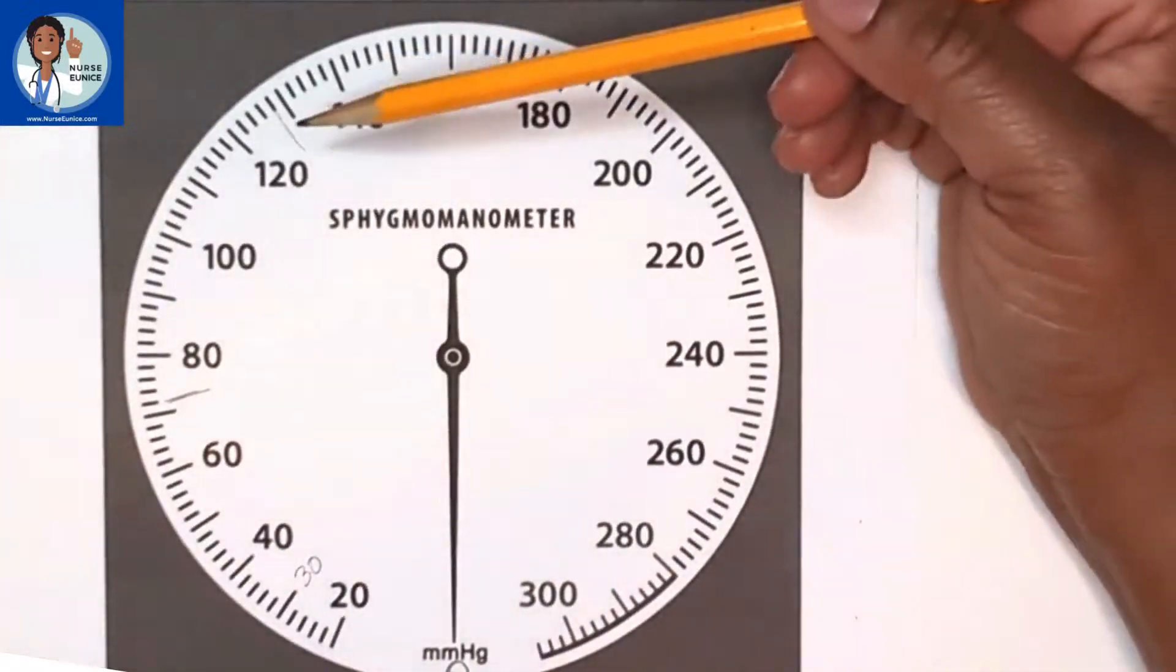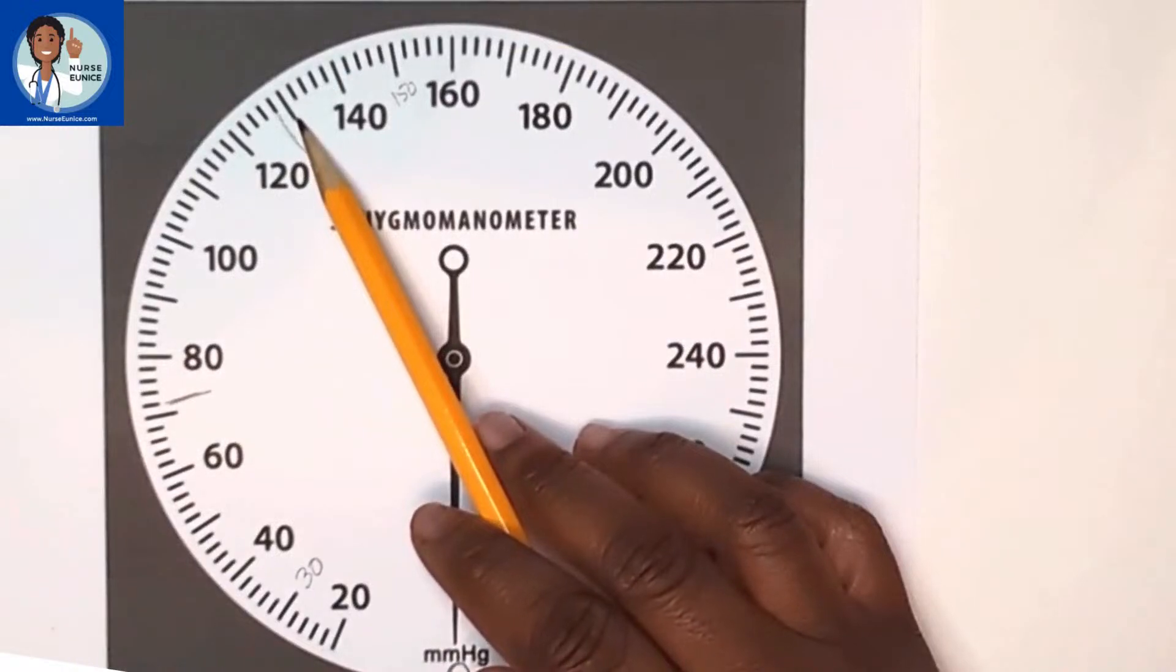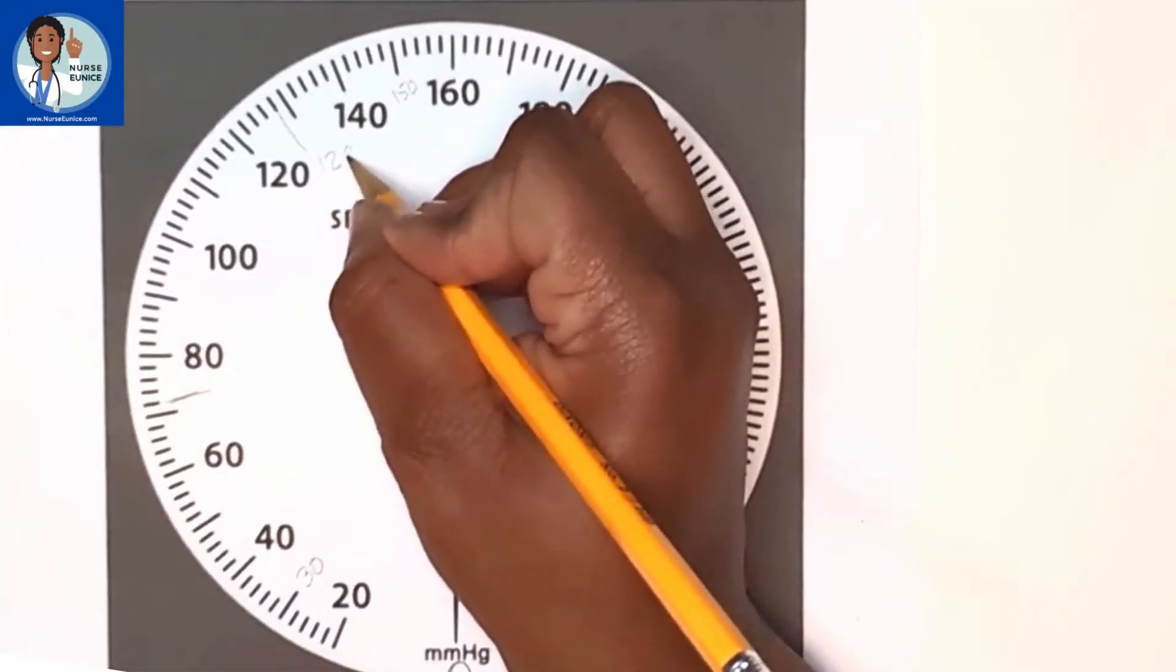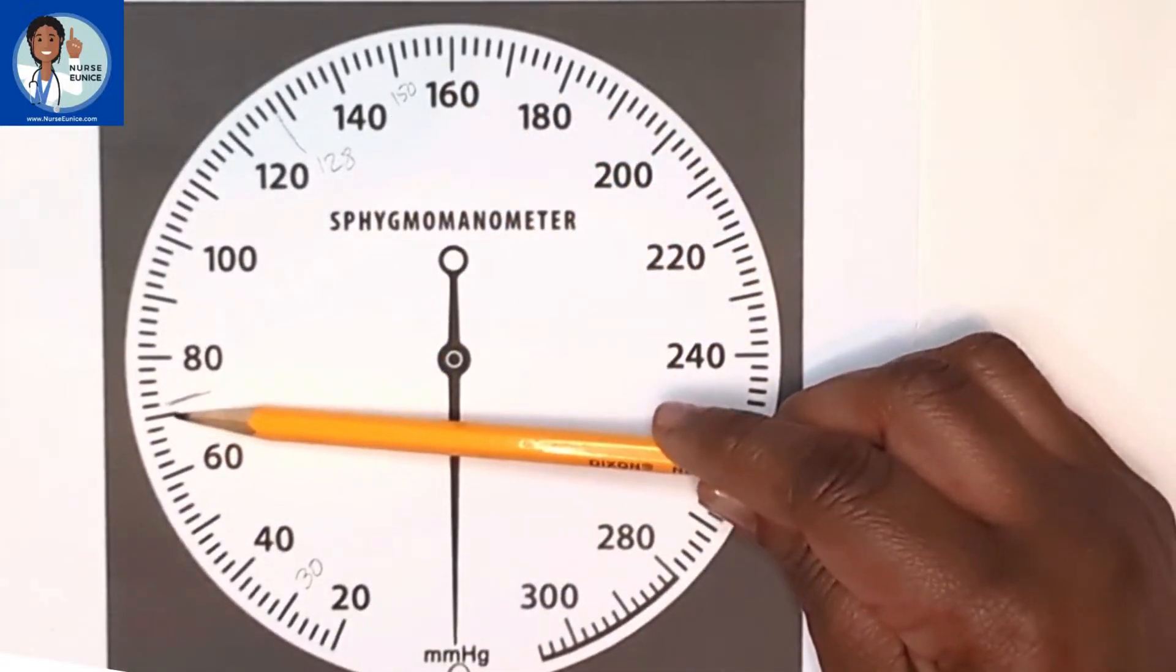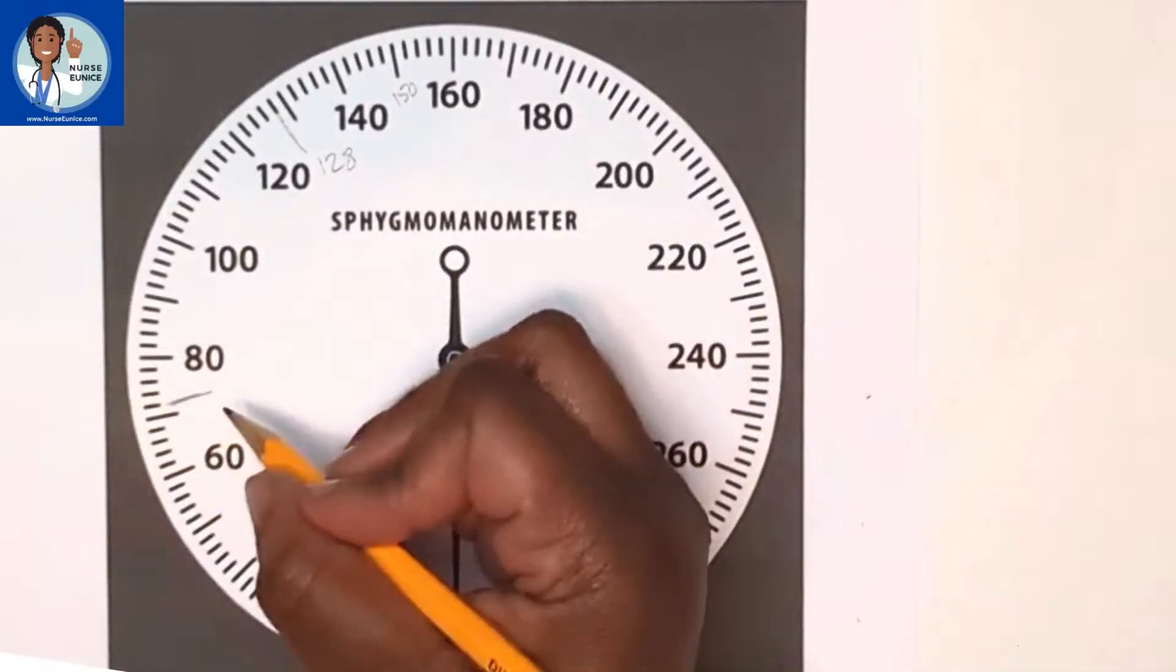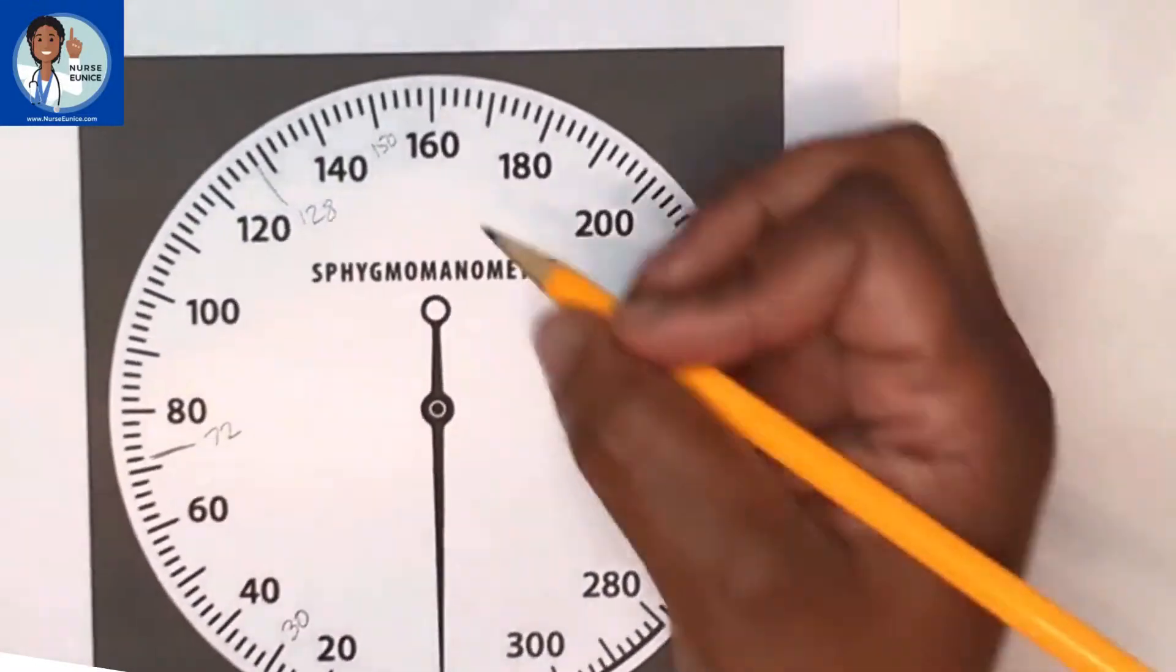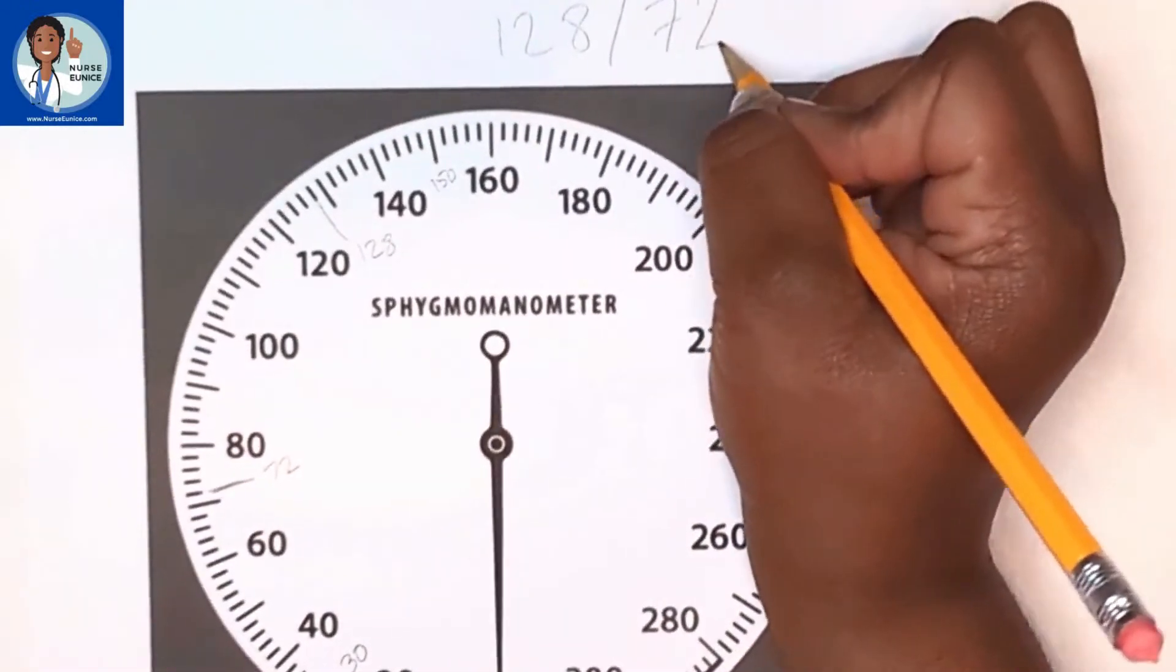You remember where you actually heard your sounds. One line below this dark line would represent 128. And then one small line above this line, if this was 60, this would have to be 70, that would make it 72. So if you were writing this blood pressure down, you charted the blood pressure being 128 over 72.